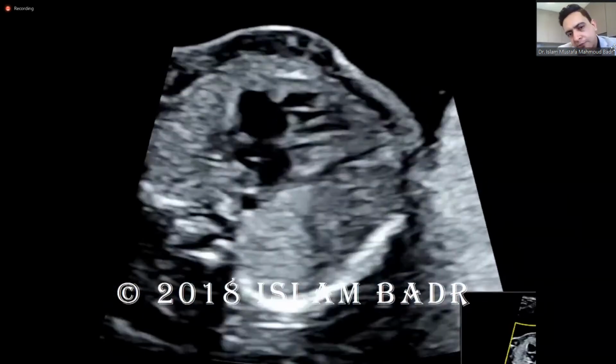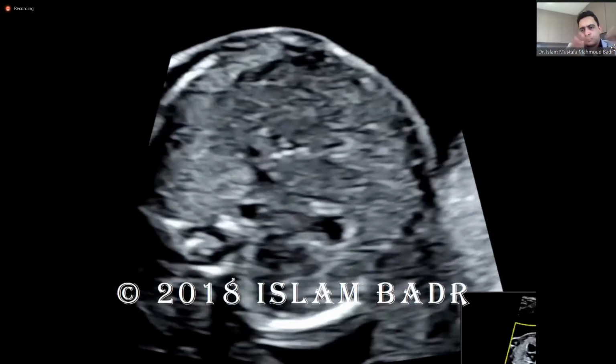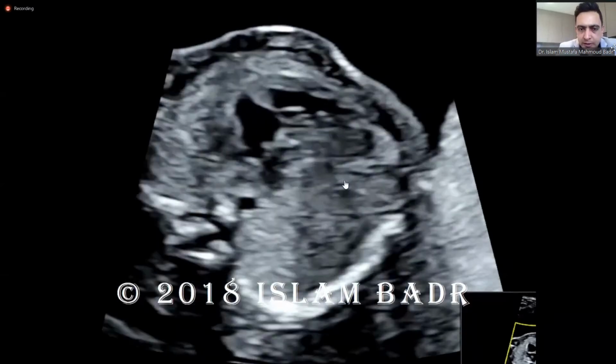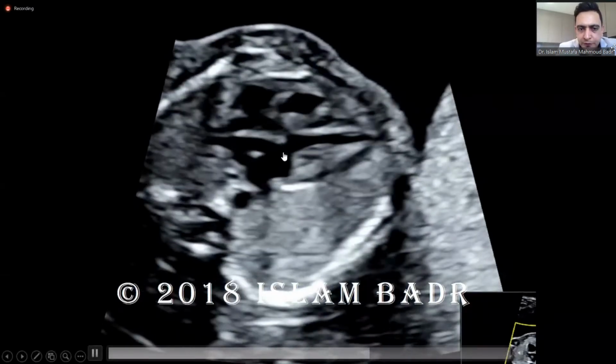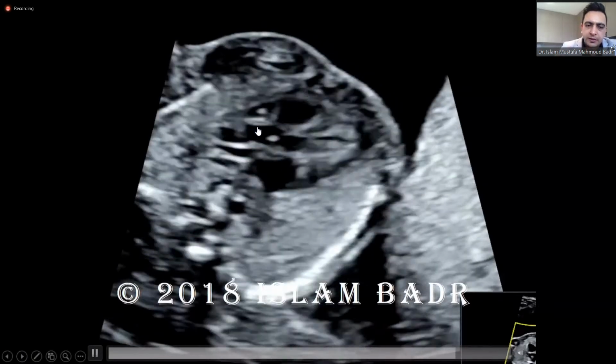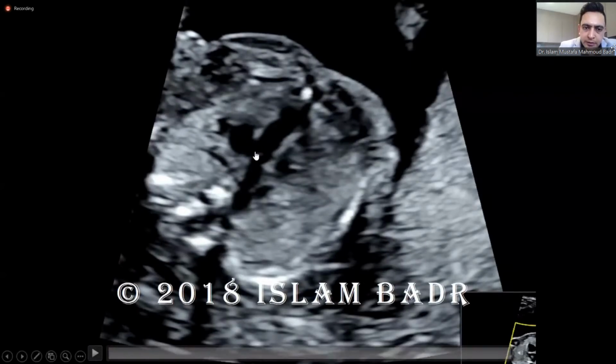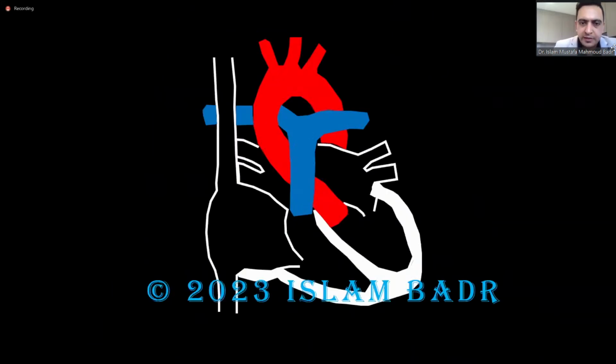This is a video that I've made back in 2018 to make an integrated idea of this technique: left atrium, left ventricle. Can you see the aorta? This is the aorta, and I'll take my ultrasound transducer and go upwards. Then I see the pulmonary, the aorta, and the superior vena cava. Okay, so this is a very quick hint about examination of the fetal heart.